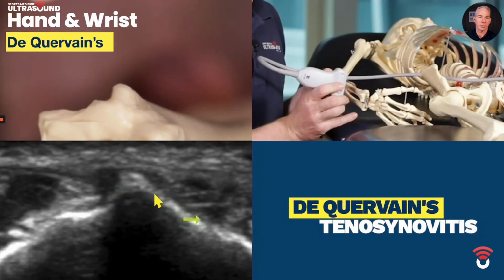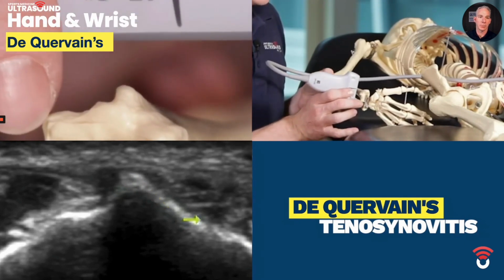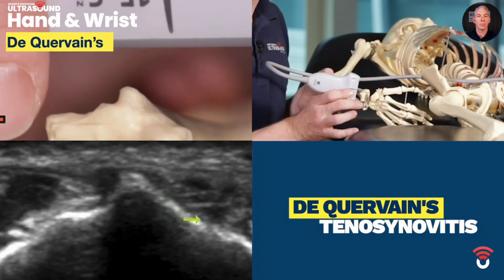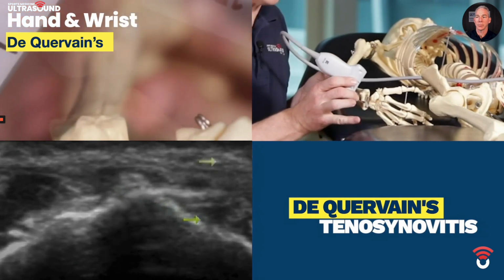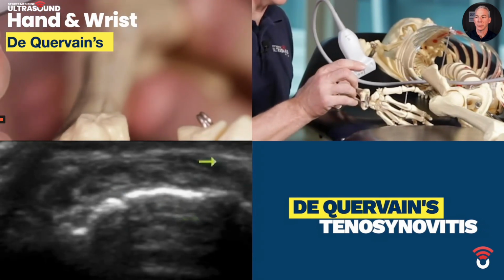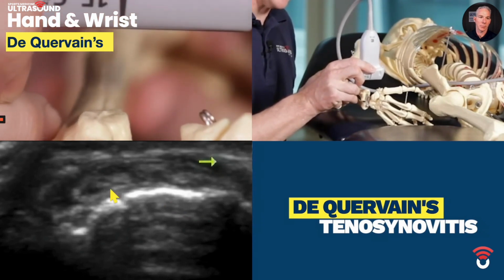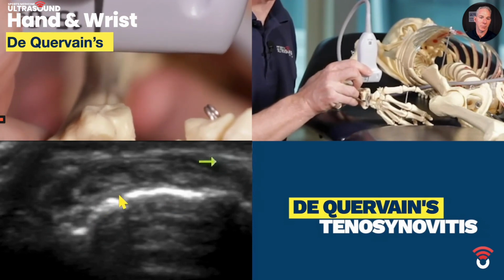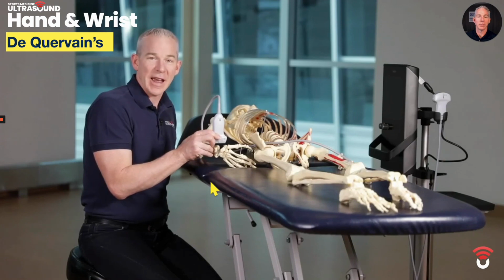The orientation of the probe is going to be short axis or cross section on the distal forearm with Lister's tubercle in the center of the screen. The movements are then going to be coming around the corner towards the thumb and looking down at the radial-most aspect of the radius. Now the area of interest is going to be the collagen tissue just sitting on top of the bone at this spot. And so this is how we scan the first extensor compartment of the wrist.